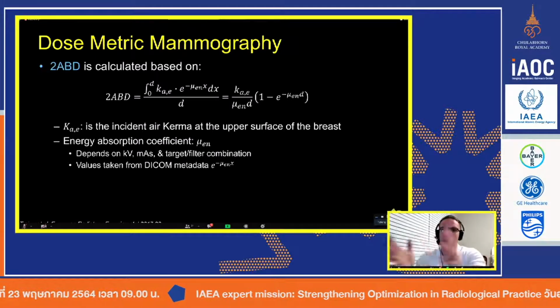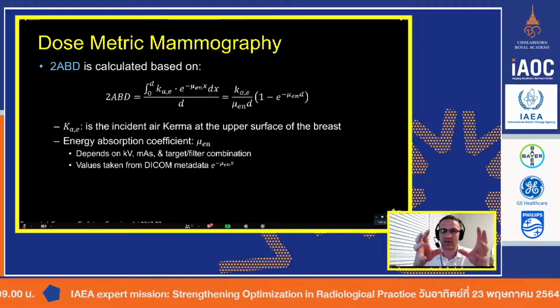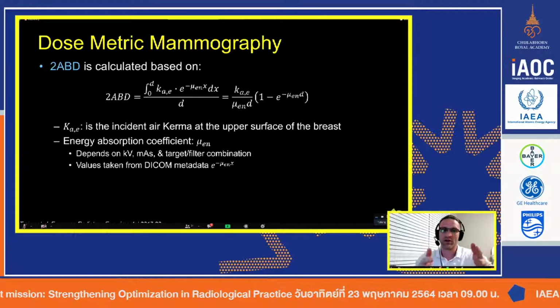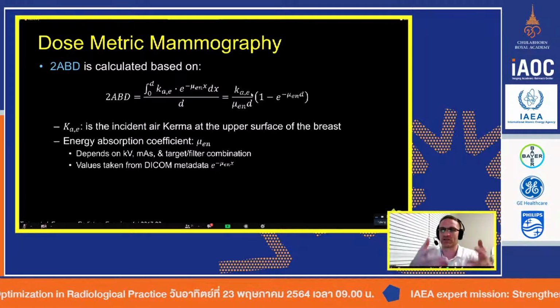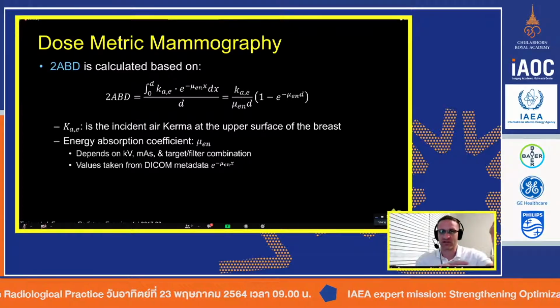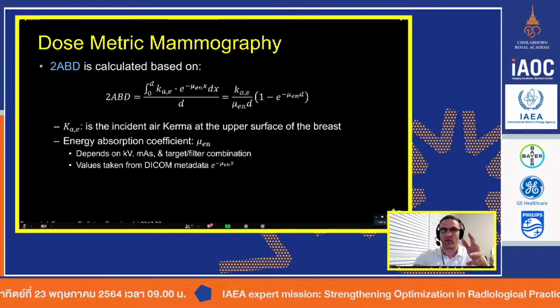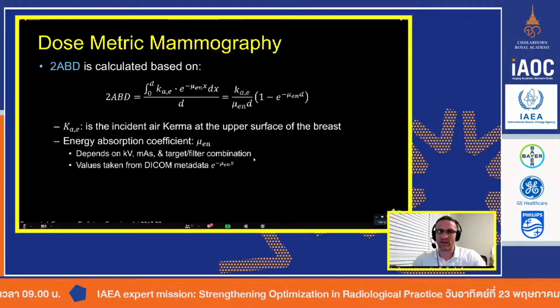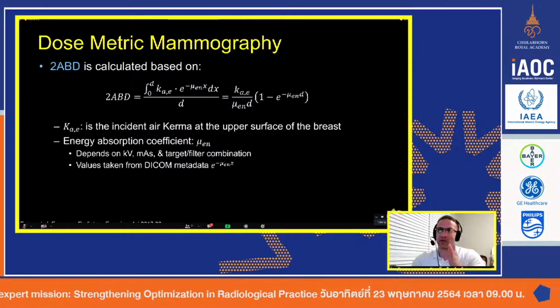So you get an image that comes up, and then you click on the DICOM data, you right click or however you get the DICOM data to appear, and you can find all of those values. And if you have software, at the national level or not, it would open up the image, take all the data out, do some calculations and spit it out. This process is more aligned with being automated.